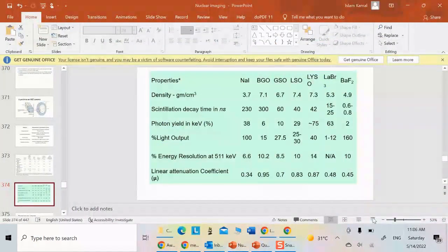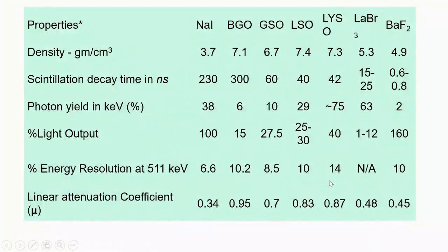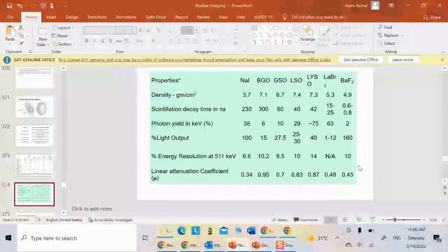We talked about the different types of crystals, and I mentioned that the choice of crystal type depends on several factors. First, when a photon enters the crystal, it interacts with an electron, causing that electron to move to what is called the conduction band. After that, it drops back down to the valence band. This downward process is what I call the decay time. I refer to it as the rapid decay time. This rapid descent helps facilitate a new interaction to occur.